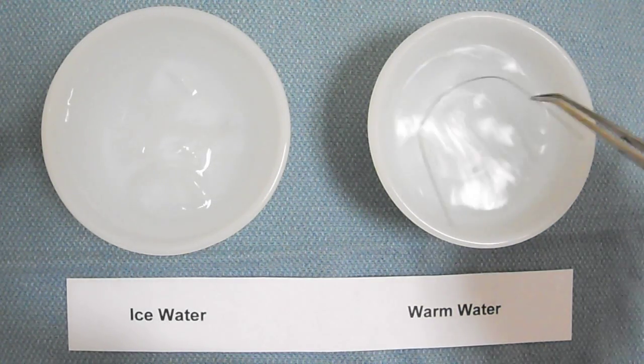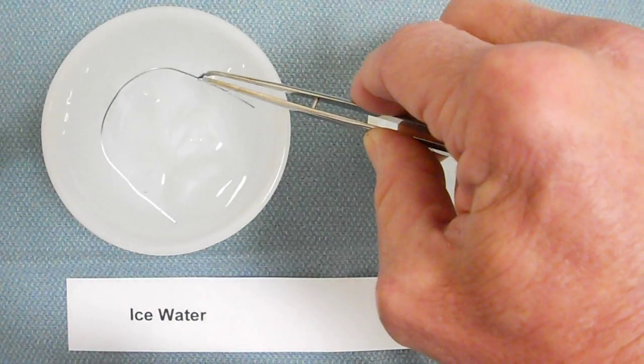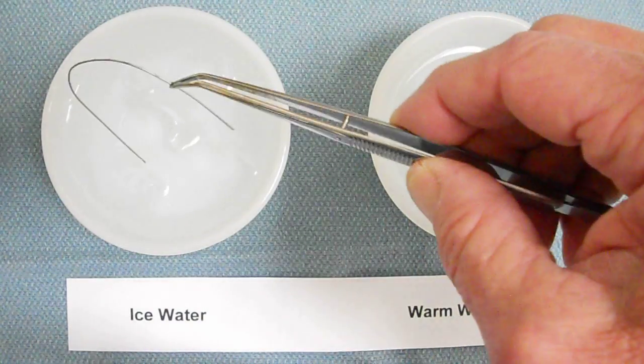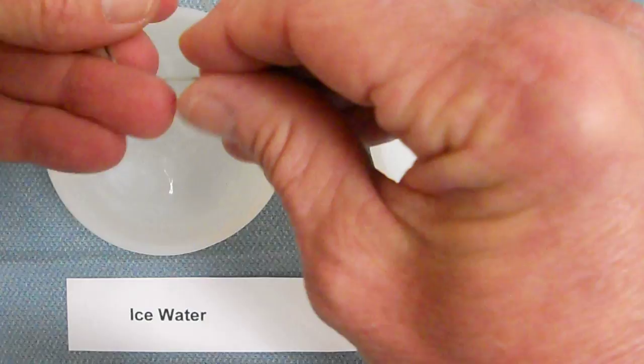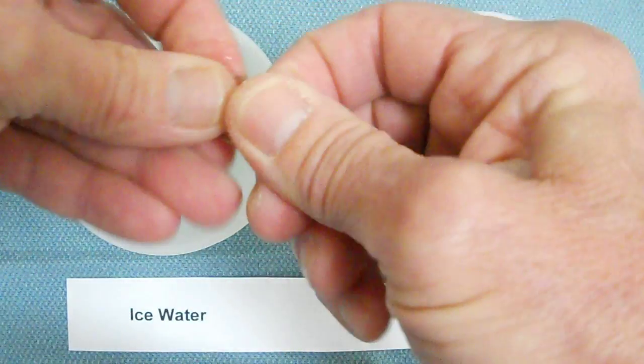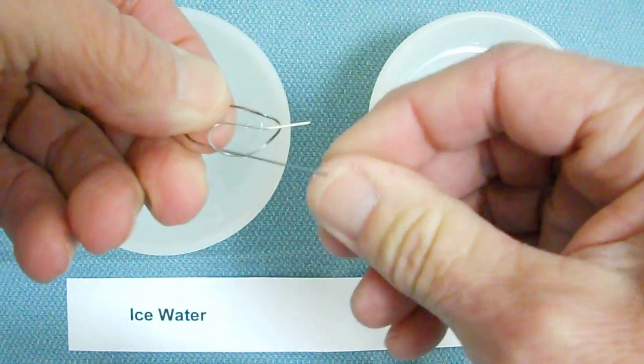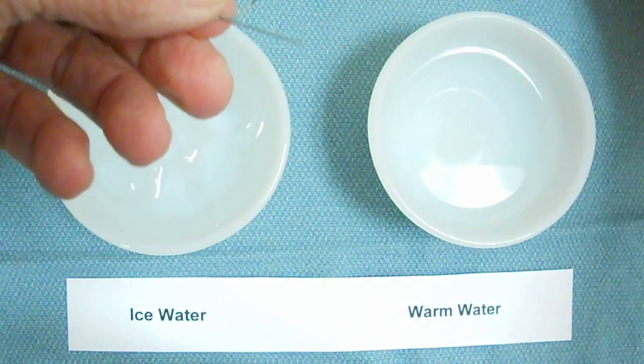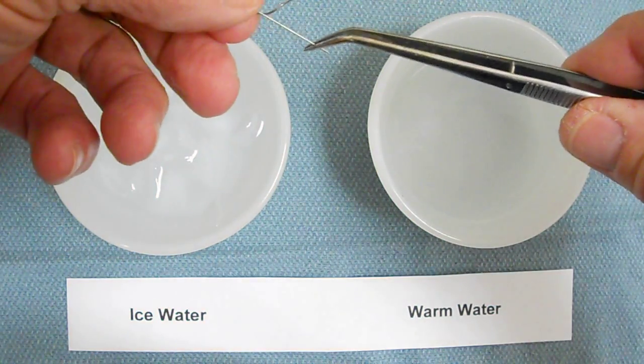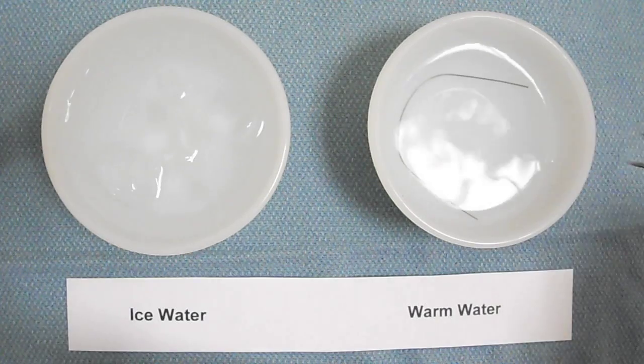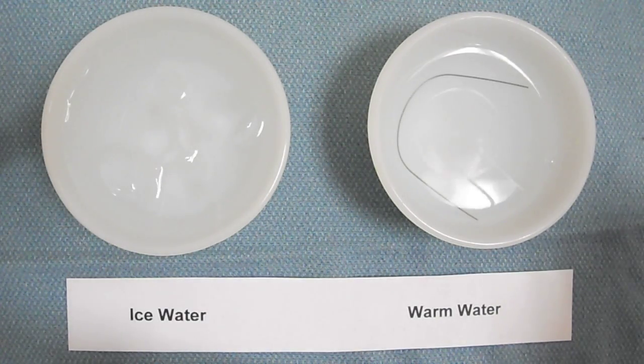This will happen many times. The next month you can re-chill the wire using a chill pen or ice, and then again you can deflect it into poorly positioned teeth, tie it in easily, and as soon as you let the lip touch it again, it turns right back into the arch form shape that it was before.